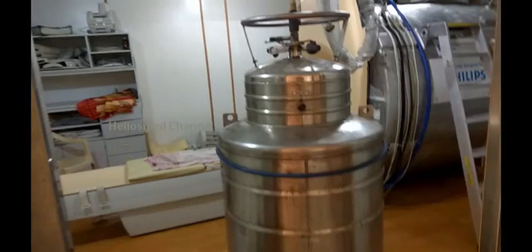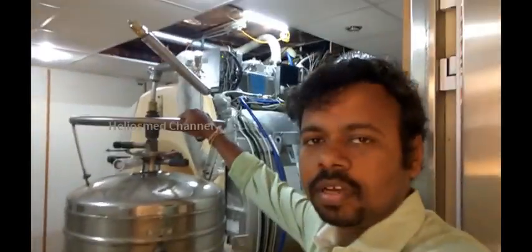So we are going to see here how we are filling helium in MRI.